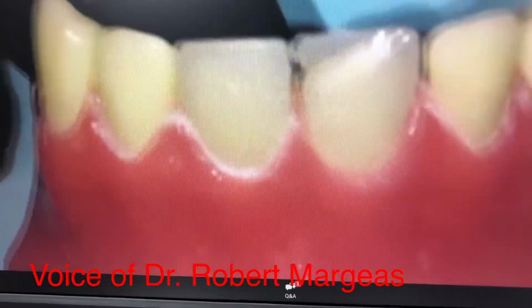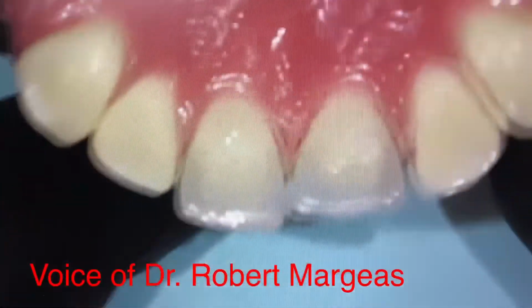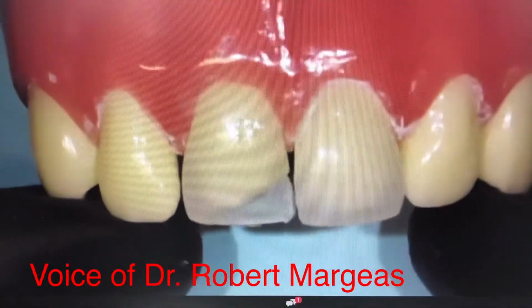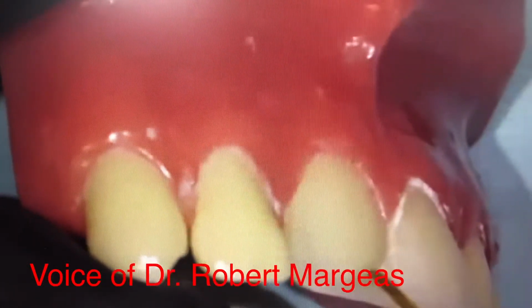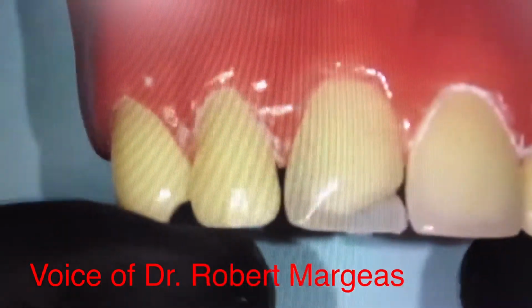So when I take this off, look at how thin that is. It's as thin as paper. It matches the trans of the adjacent tooth, and you can start to see what I'm trying to do. If you brought it out to here, which is about right there, you have no room for your dentin. You have no room for the dentin.